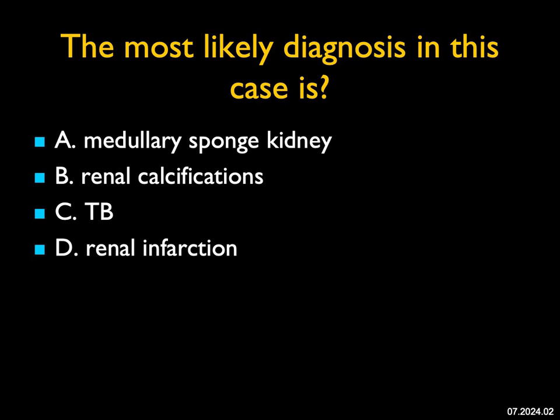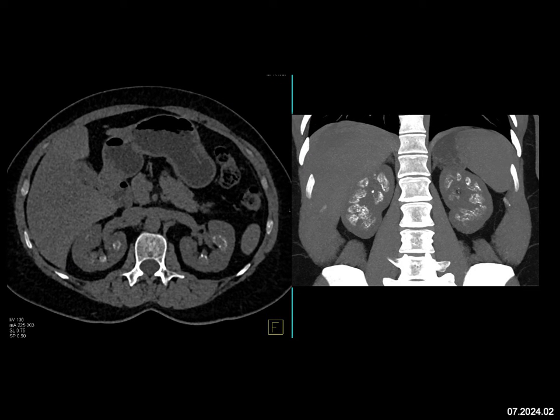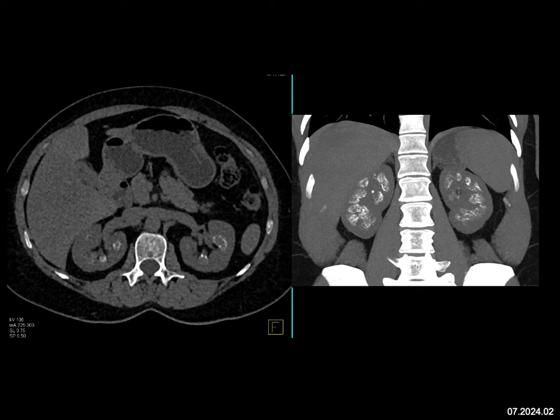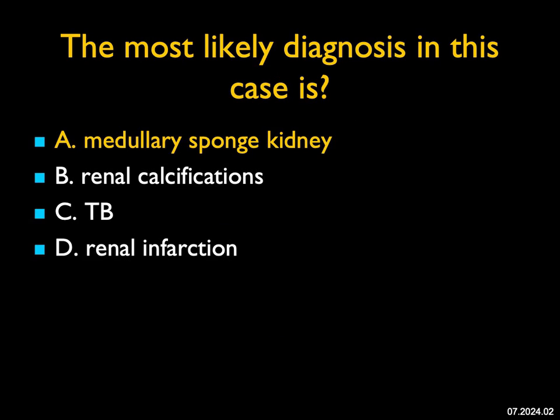The most likely diagnosis in this case? When you look at the non-contrast axial and coronal views, you see extensive calcification in what seems to be the calyces. You can answer under what's likely renal calcifications — that's true, so you can get PAR credit. TB can have calcifications, but the kidneys are typically small or scarred. With renal infarction, what you're going to see is loss of cortex, maybe edema early, but not these diffuse calcifications in the pattern this patient has. This appearance is classic for medullary sponge kidney — bilateral, masking the calyces, a really good diagnosis.